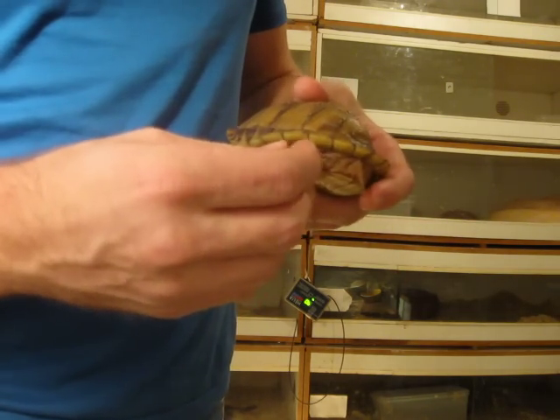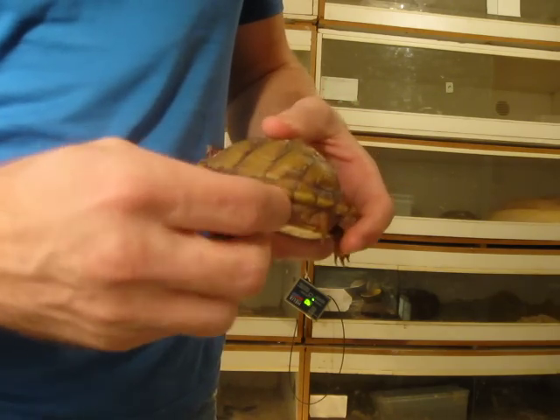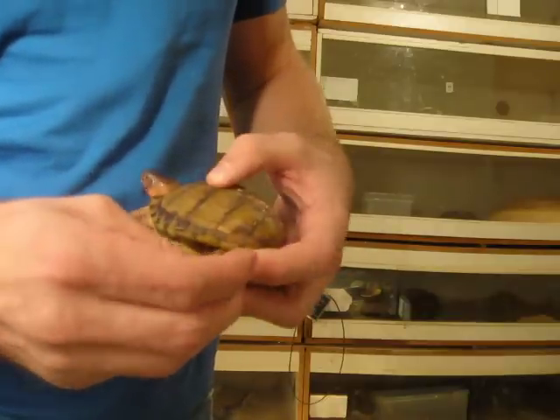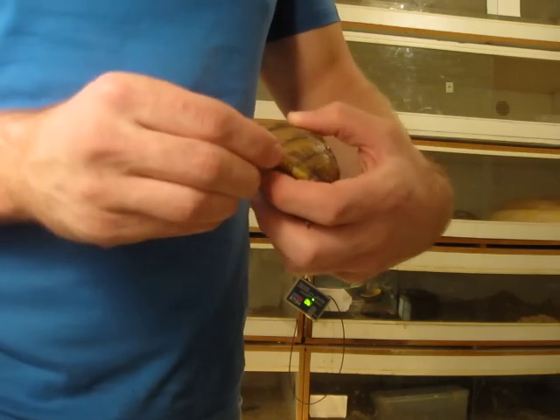Today we're going to give this one an injection in the leg, if I can get his leg out. Now there's not a whole lot of meat to go by on these guys' legs — there's not a whole lot of fat or muscle on the leg, so it's going to be kind of tricky to give them their injections.